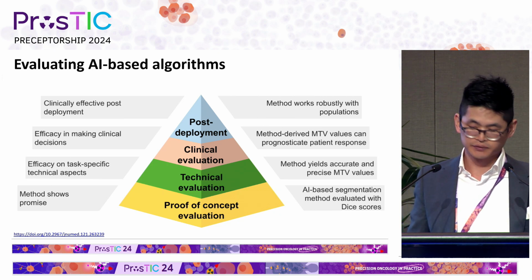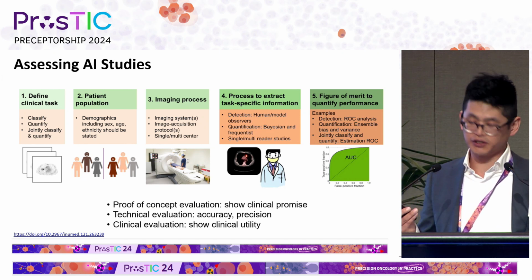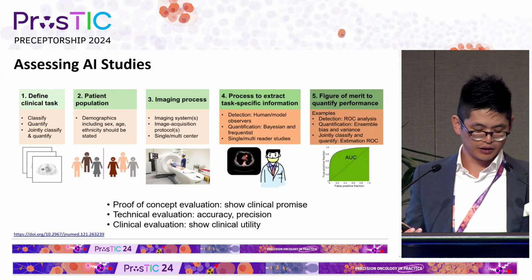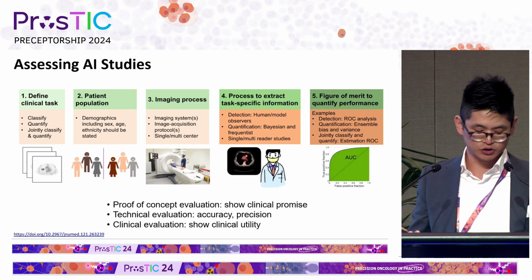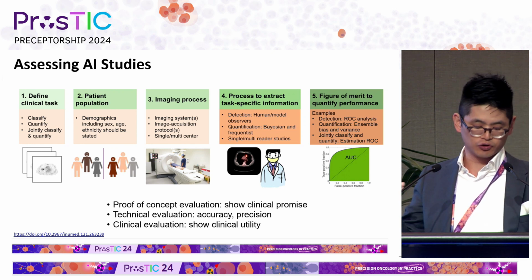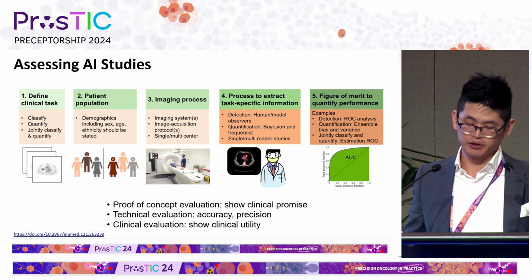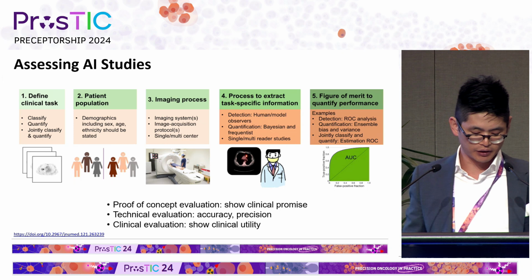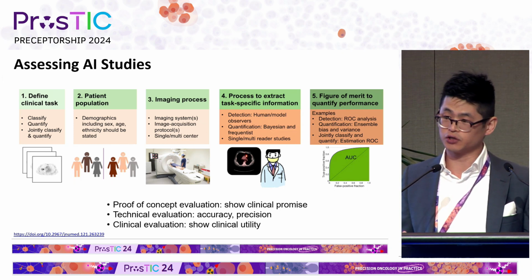And to design these trials, first we would identify the appropriate tier, and then we would define that clinical subtask. And then report on the patient population to avoid cumulative bias down the track. And then from those, you can determine an appropriate figure of merit for this claim. Now, this particular paper and that link, I highly recommend, and the supplement is worth looking at because it really is comprehensive and lists out those figures of merit. So with only better evidence and trials can we hope to practically bring AI into the clinical setting.